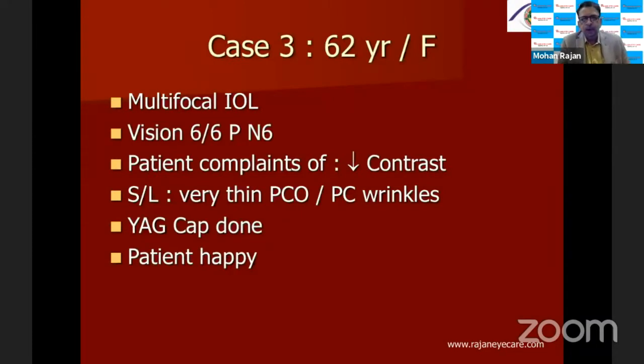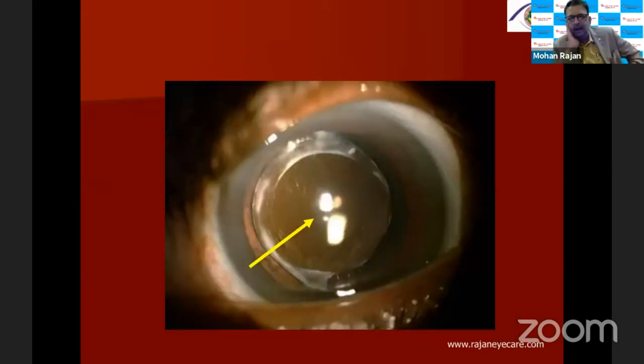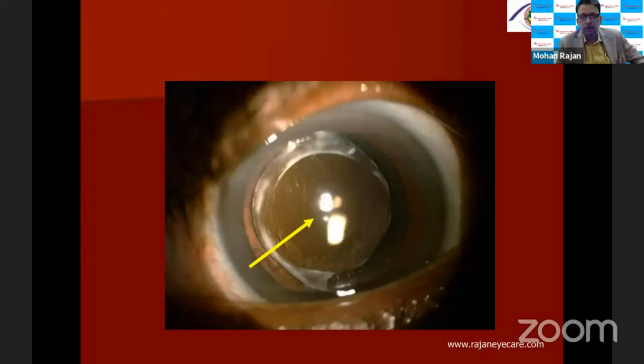Case 3, you can see a multifocal IOL. Patient is having 6/6 N6. Patient complains of decrease in contrast. If you notice, there is only a thin line on the posterior capsule. In a multifocal lens, please understand, even a wrinkle on the posterior capsule can decrease the contrast sensitivity significantly. Once you do a YAG laser for this patient, the patient became very happy. The vision was very good, and the contrast vision also improved. Make sure you do the YAG laser much earlier than normal. Even a wrinkle on the posterior capsule can affect the contrast vision significantly.